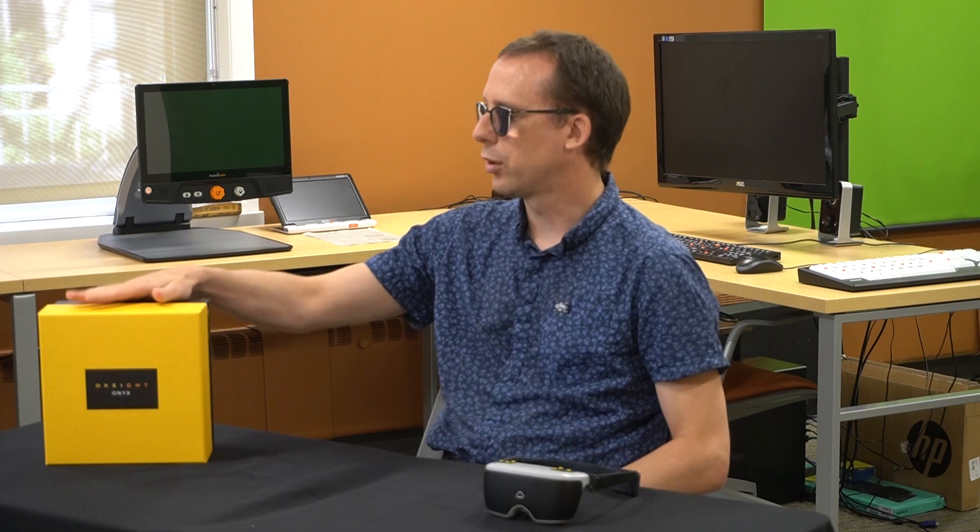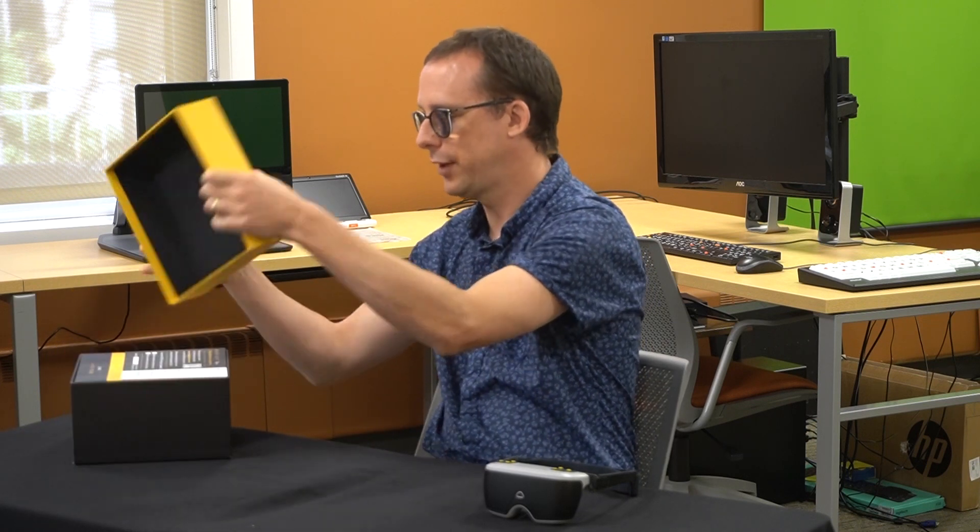Before we jump in and take a look at the features, let's take a look at what we get in the box. First of all, we have the box itself — quite attractive, I would suggest. Nice thick card if you're into that type of thing. And if we open it up, we can see the contents inside.